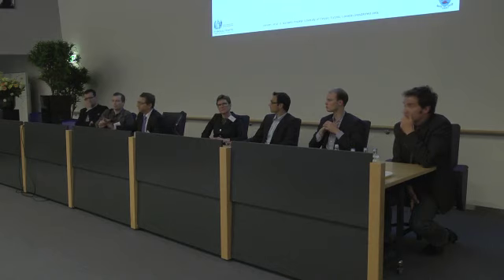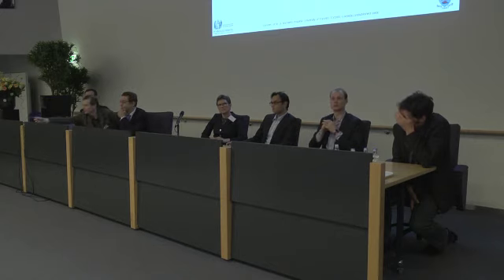So from that perspective, if anybody should make a conscious decision in that sense, and I think that refers directly to what Christer said, it's a matter of unloading. If somebody feels not comfortable with that EDI level and wants to bring the EDI signal down, then he needs to do what Christer just recommended: turn the Nava level up.